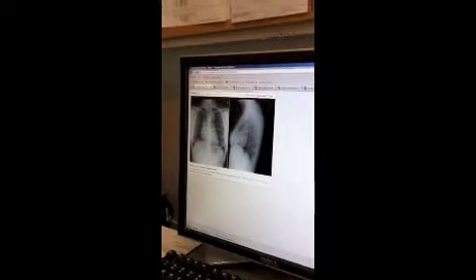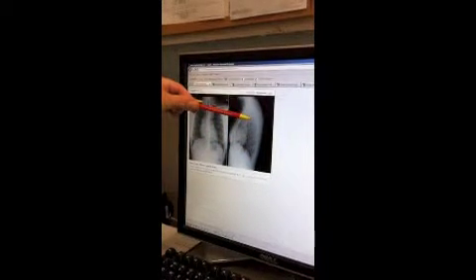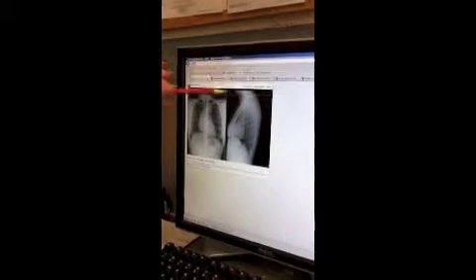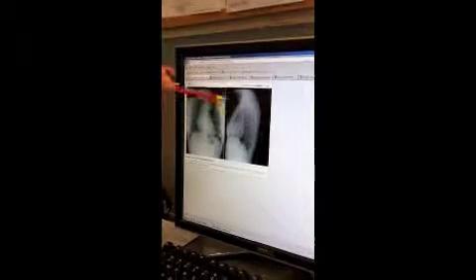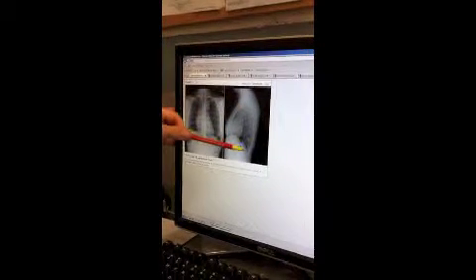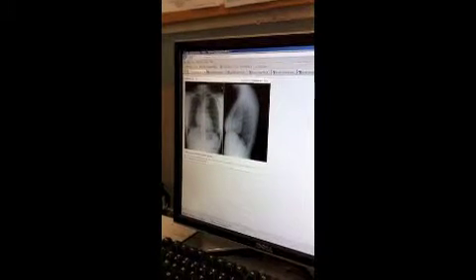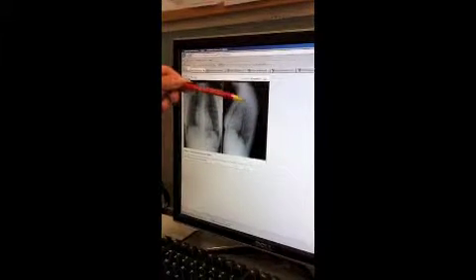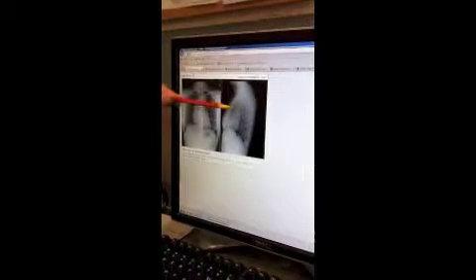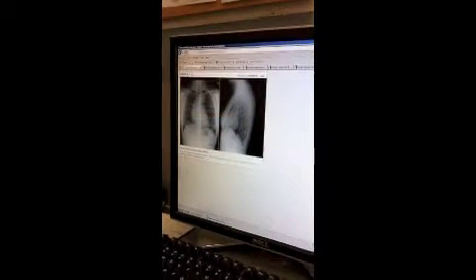For the lateral chest, you want to be able to see good superimposition of the posterior ribs. You want the arms out of the lung fields, no rotation of the sternum. You want to be able to see the entire lung fields, apices to costophrenic angles. And you want open thoracic vertebra spaces and intervertebral foramina. And you also want the hilum region roughly in the center of the radiograph.